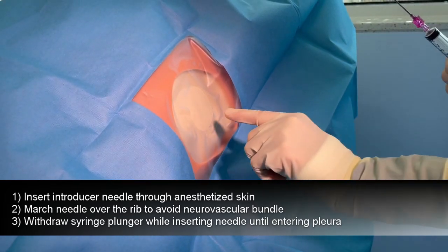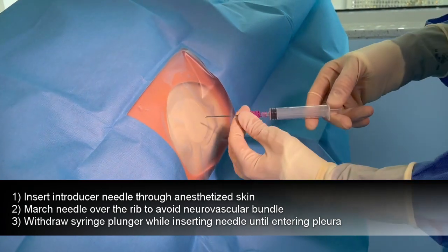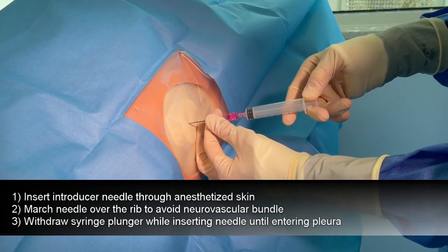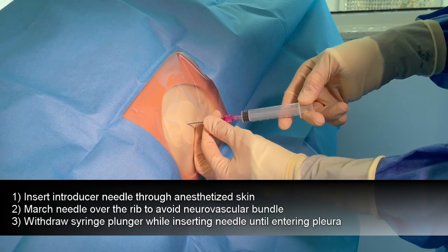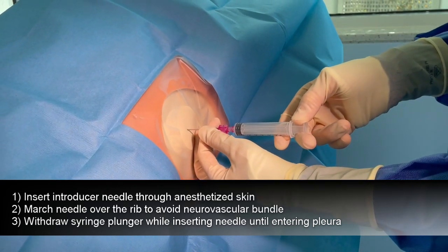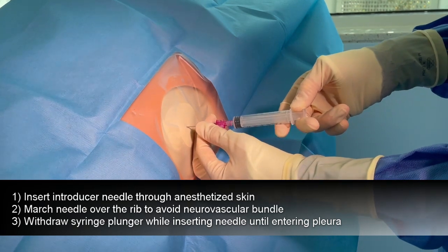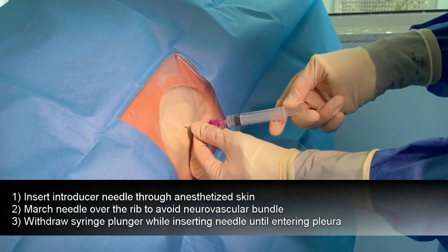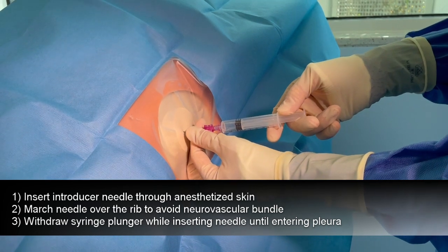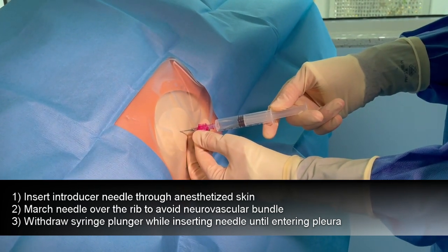Next, take your introducer needle and go through the anesthetized portion of skin down to the rib. March over the rib and enter the pleura just over the rib, avoiding the neurovascular bundle. Aspirate as you go along and you will get air into your syringe when you enter the pleural space.